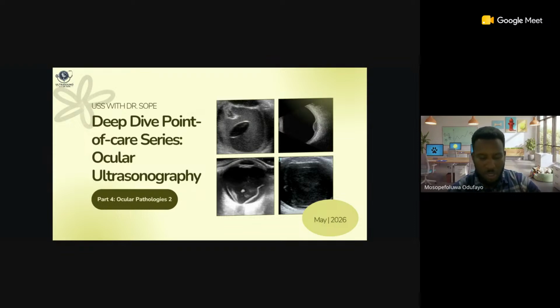We've talked about the anatomy, demonstration, and reporting. I've attached the link of the webinar that talked on the demonstration and reporting. We will be seeing a live demonstration video shortly that we can watch to see how to do an ocular scan, as it was said.